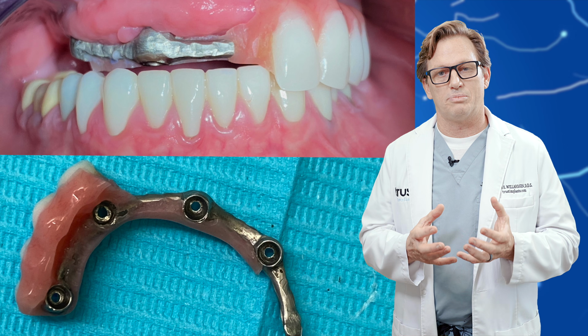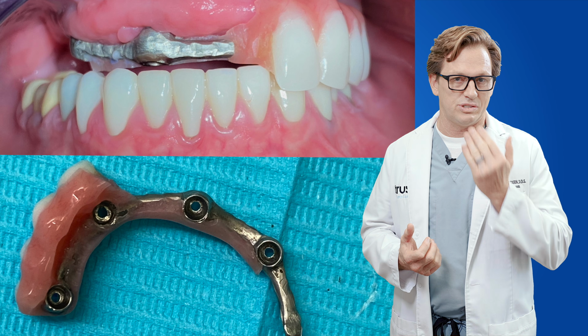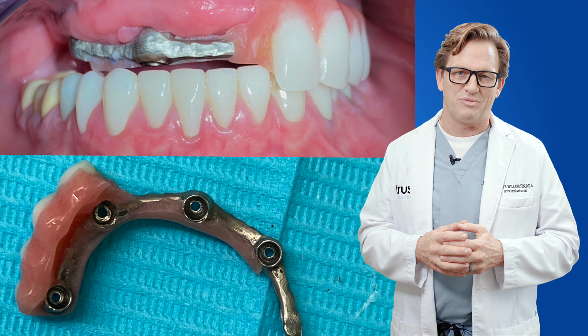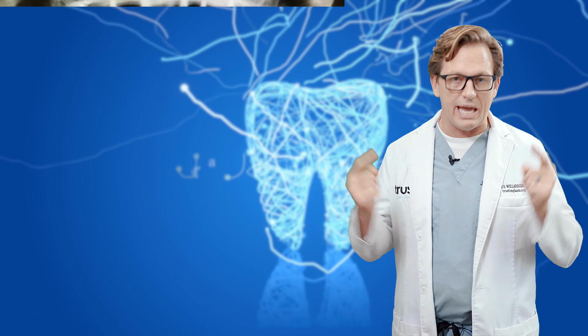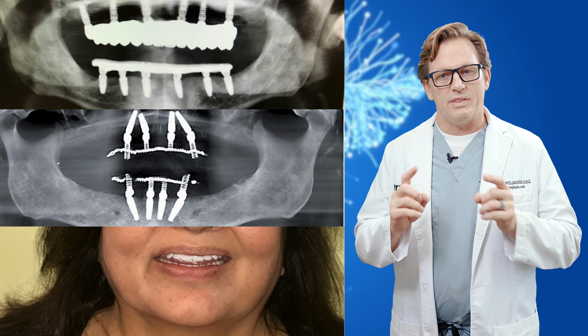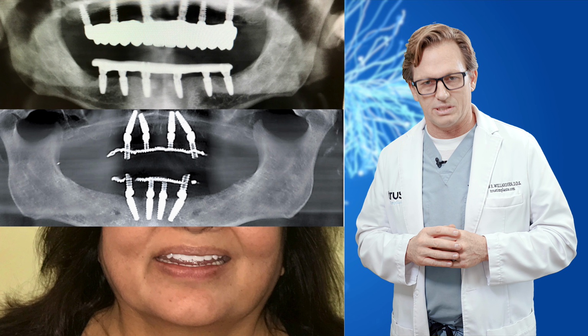She's having to use the prosthesis like she did before she lost her teeth, and all the forces are in the front. And that's why I don't like the all-on-4 procedure, because all of the implants are concentrated in the front of the jaw, both the top and the bottom, and then they angle the implants at extreme angles. And so that implant distribution is not favorable to long-term success.